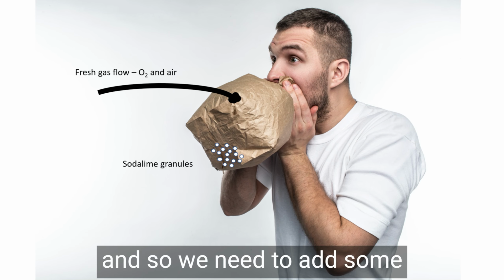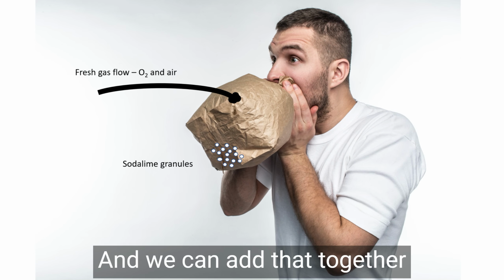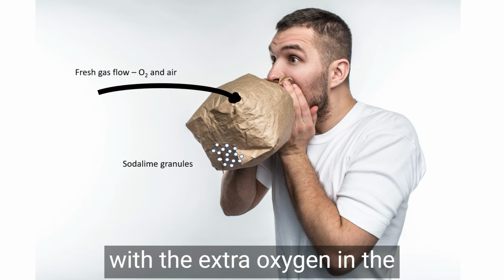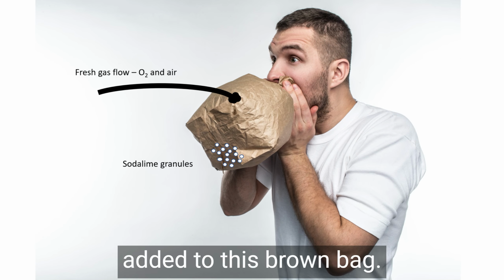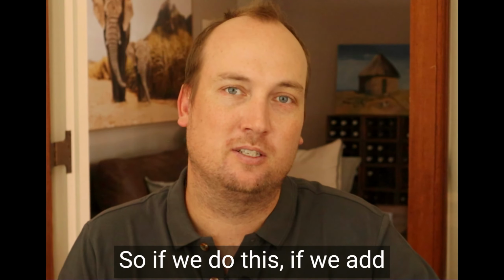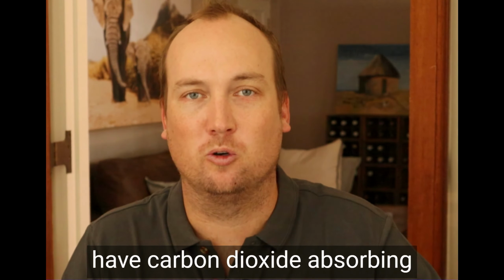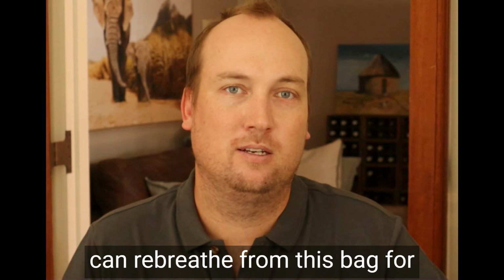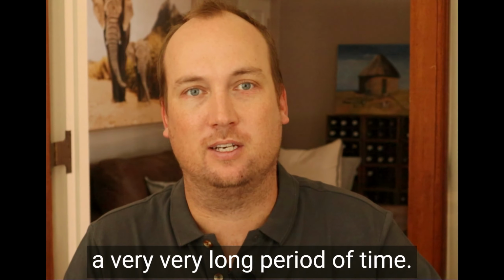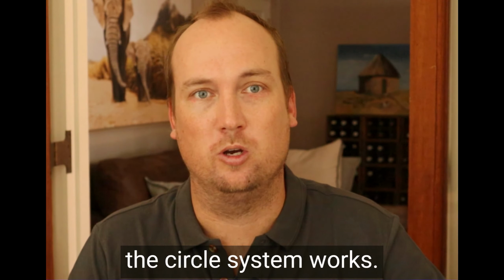And so we need to add some extra air into the bag or into the system to keep the bag full. And we can add that together with the extra oxygen in the fresh gas pipe that's being added to this brown bag. So if we add extra fresh gas flow and we have carbon dioxide absorbing granules in the brown paper bag, then this man in this picture can rebreathe from this bag for a very, very long period of time. And this is exactly how the circle system works.